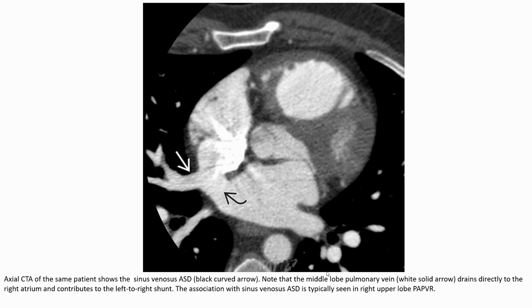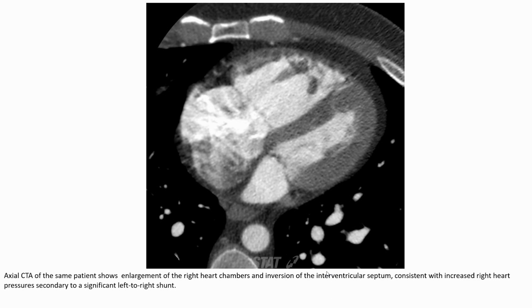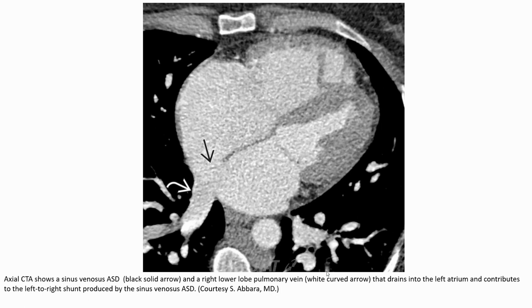The association with sinus venosus ASD is typically seen in the right upper lobe PAPVR. Axial CTA shows enlarged right heart chambers and inversion of the interventricular septum, consistent with increased right heart pressure secondary to a significant left-to-right shunt. Another axial CTA shows sinus venosus ASD and a right lower lobe pulmonary vein draining into the left atrium, contributing to the left-to-right shunt produced by the sinus venosus ASD.